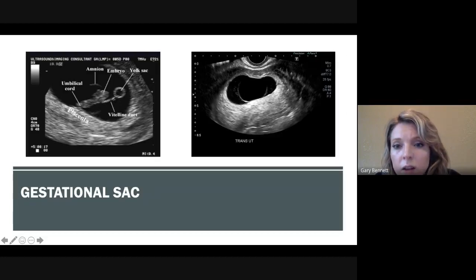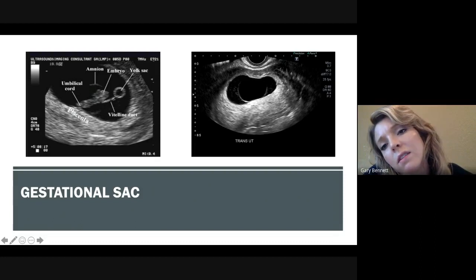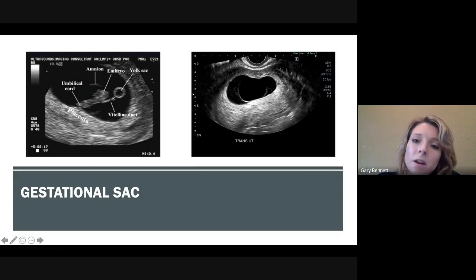See if we see anything in here. Something to notice is there's a little bit of debris in this image, which is outside the amnion here. Maybe not super concerning. If we see some other factors, then that might be concerning for a missed abortion, a fetal demise. But if crown rump length looks pretty good and everything else, we'll probably carry through just fine. But just to notice, you can see a little bit of echogenicities out here. That's just some debris.